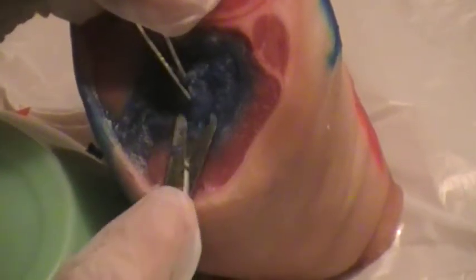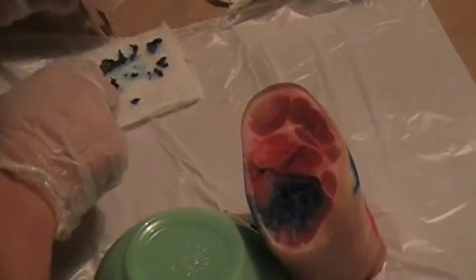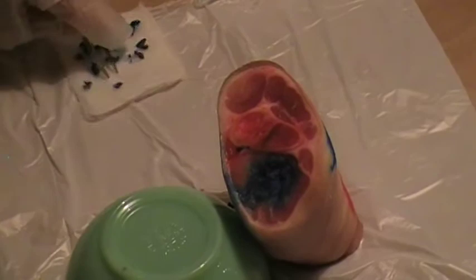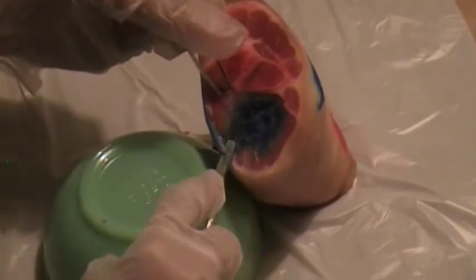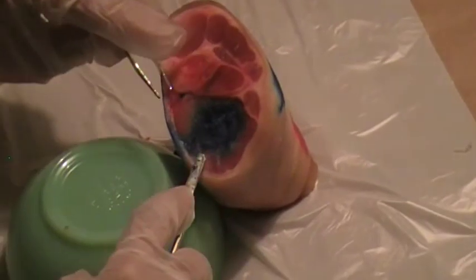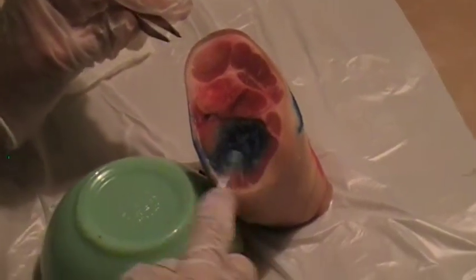I just want to hold it tight and then carefully cut off small pieces. And you can see I've got quite a lot that I've built up over here on the gauze. I think I'm satisfied with that depth in the area that I've done, and then we'll use some other kind of debridement method to keep cleaning the wound.